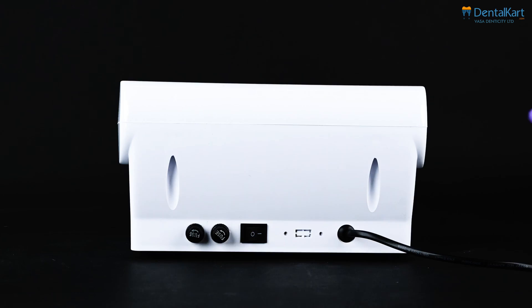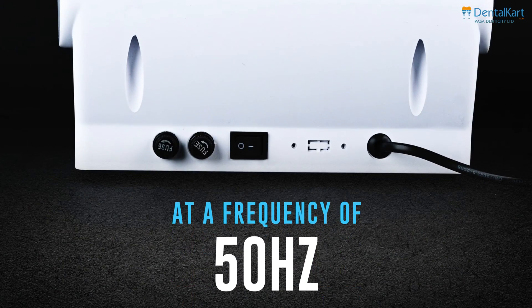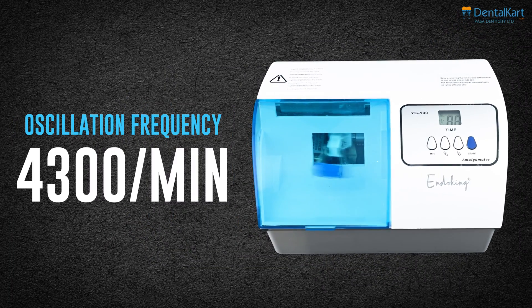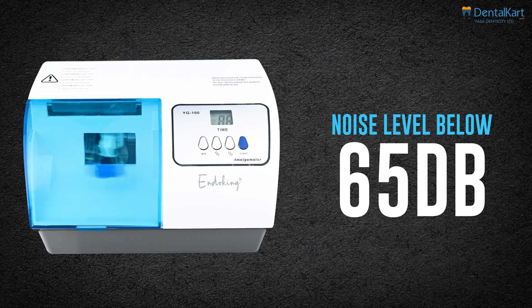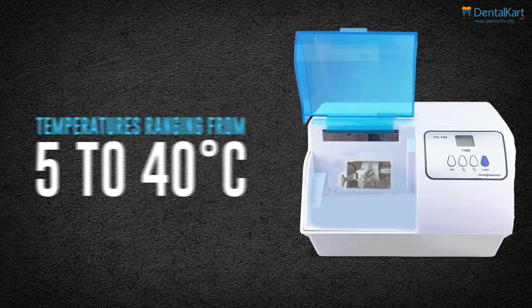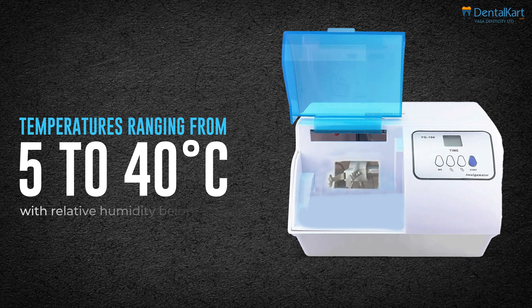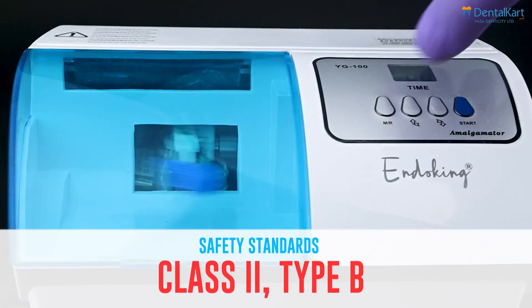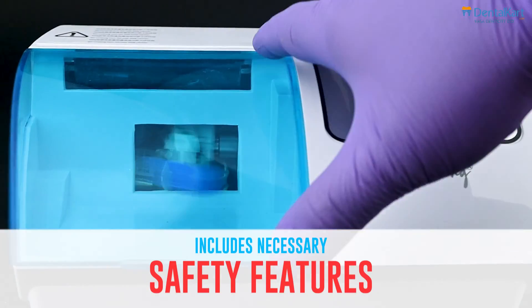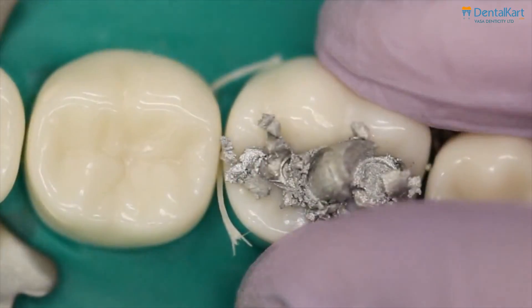It operates on AC 220V at a frequency of 50 Hz, consuming 220 watts of power. The oscillation frequency is 4300 per minute, with a noise level below 65 dB. It operates in temperatures ranging from 5 to 40 degrees Celsius with relative humidity below 80%. The device meets Class 2 and Type B safety standards and includes necessary safety features for reliable operation.